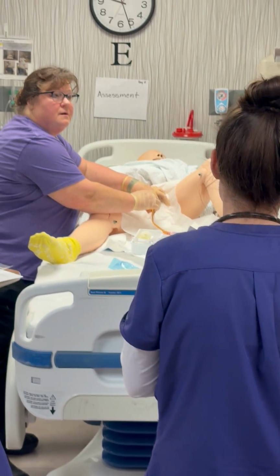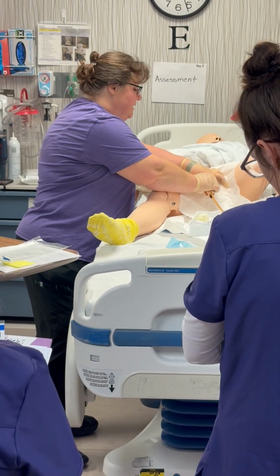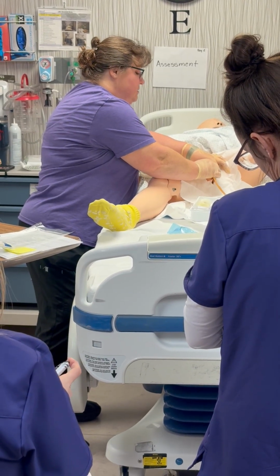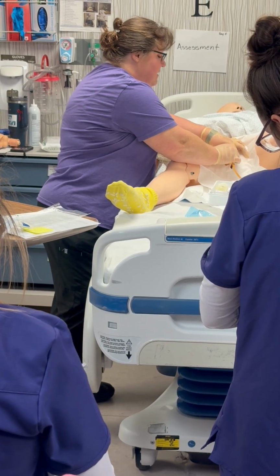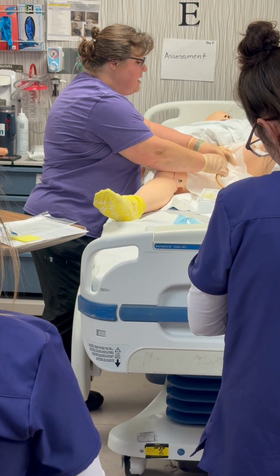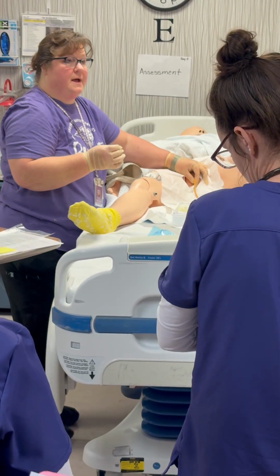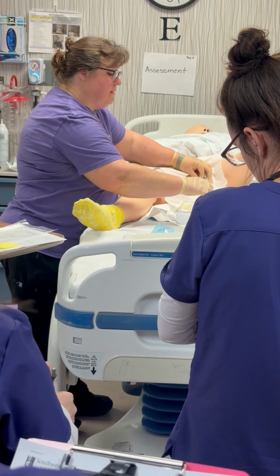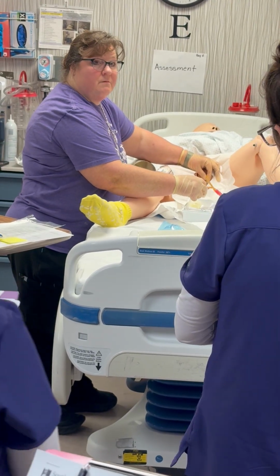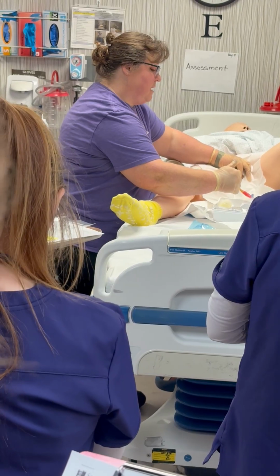Once I see urine, what should I do? 2 to 3 more inches. Okay, so then I put this in 2 to 3. This is not wanting to go in today. Okay. And then I'm gonna take my non-sterile hand and hold that, okay? To keep it stable so that I can come down here and put my fluid in, okay? So I'm putting my fluid in, okay?